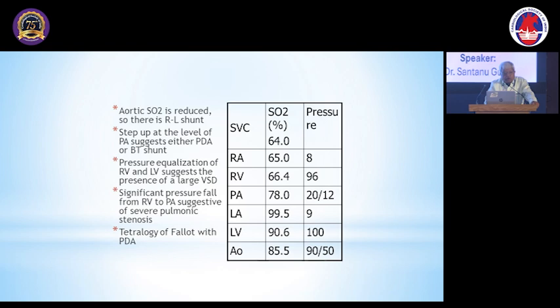IVC is streaming across the ASD. You know, all of you know about that. And IVC, or a systemic vein connecting with the left atrium, that remains another issue.